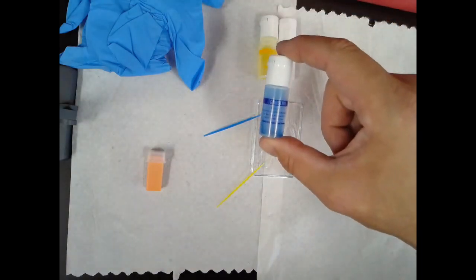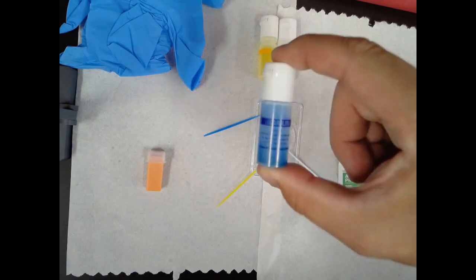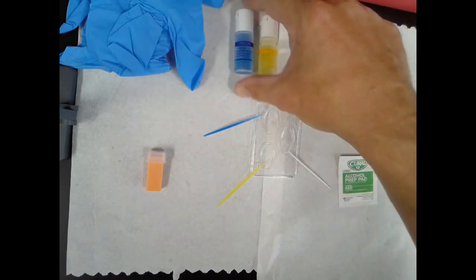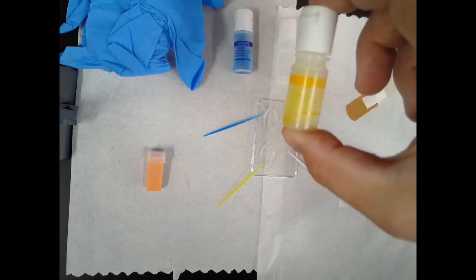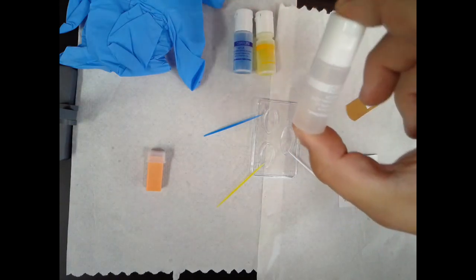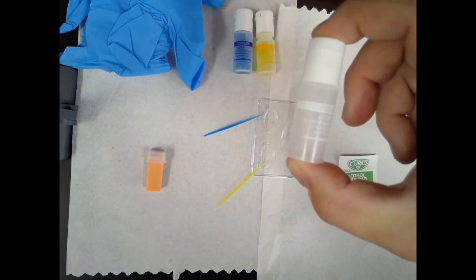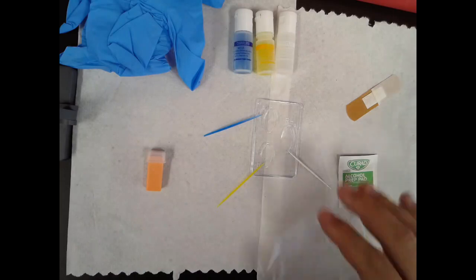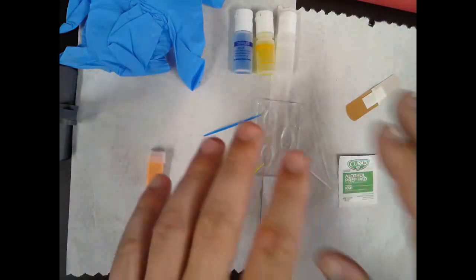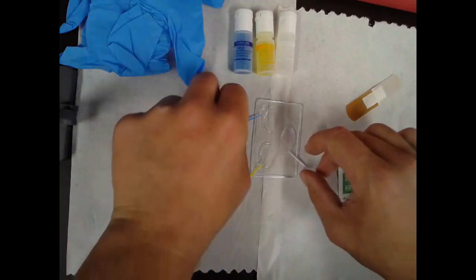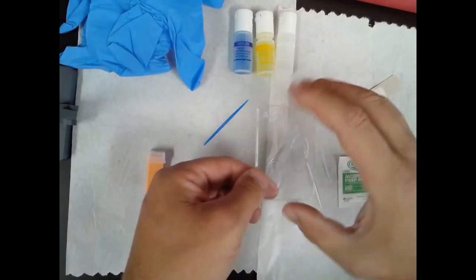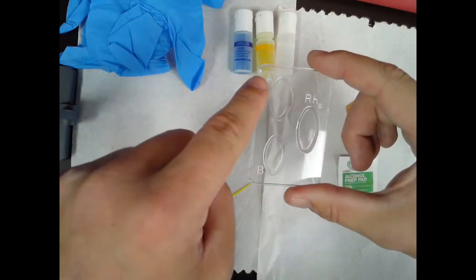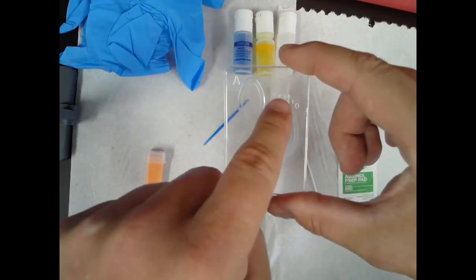When you see these antibodies in serum that are blue in color, that's usually universally A antibodies. In yellow, these would be B antibodies, and then the clear colored one here, these would be antibodies for the D antigen or the RH factor. If you look closely at this tray here, you'll see there are three basins in here, and then you'll see there's an A, a B, and an RH.